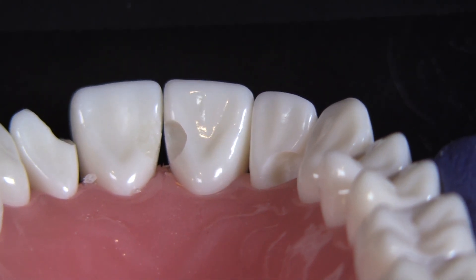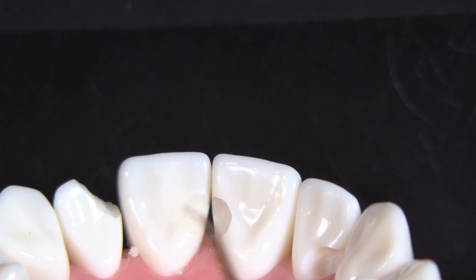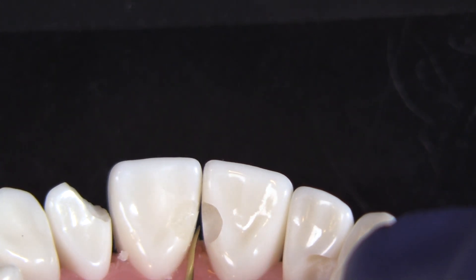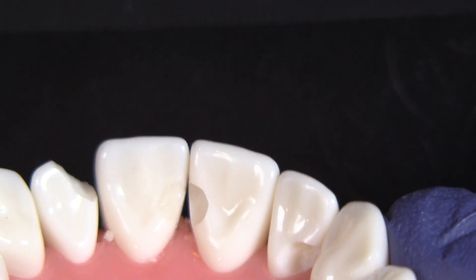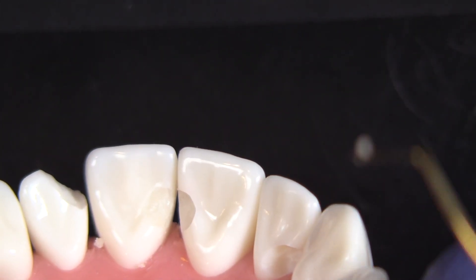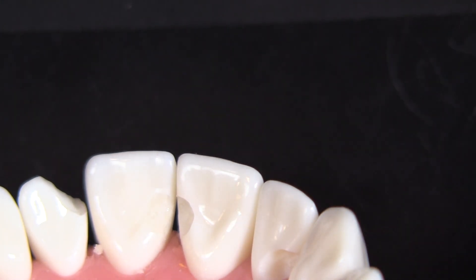Oh, look at that — great shape, perfect contour. This part here I can shape with my instrument or with a burr. But the thing that's really hard to recreate is this interproximal emergence profile, especially as you get down towards the gums. A lot of the dentistry done on lower anteriors is geared towards cosmetics, but what's really important is the seal and the function. That's what it's all about, because otherwise — it doesn't matter how nicely shaped it is if it starts to stain six months later.